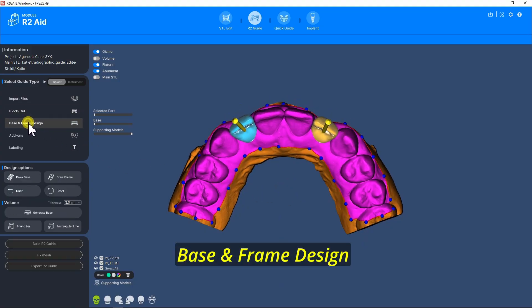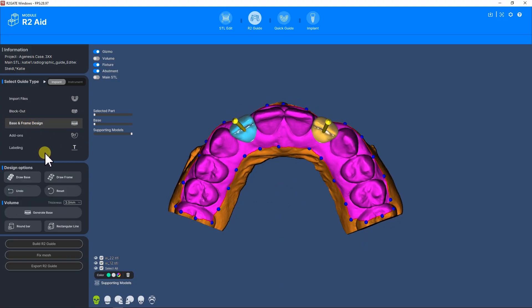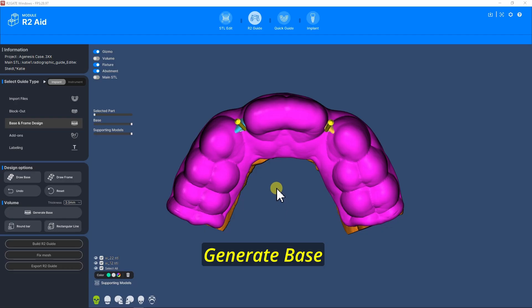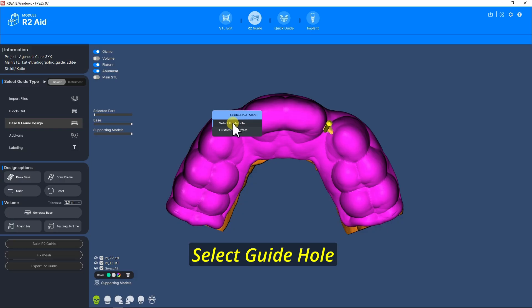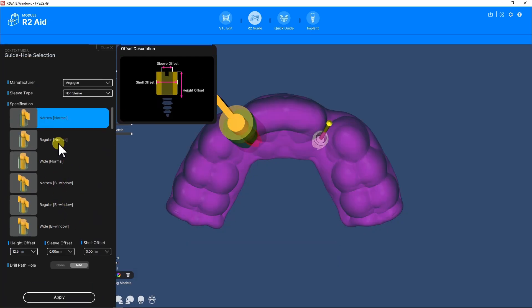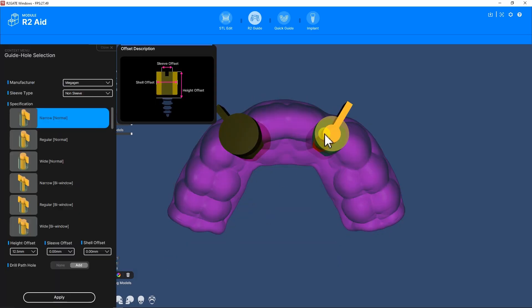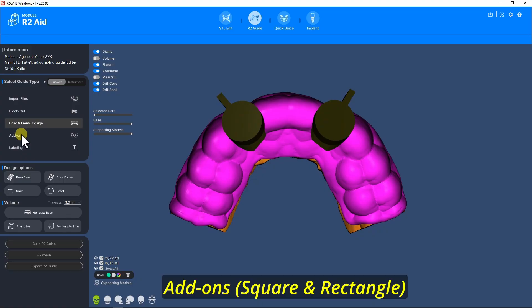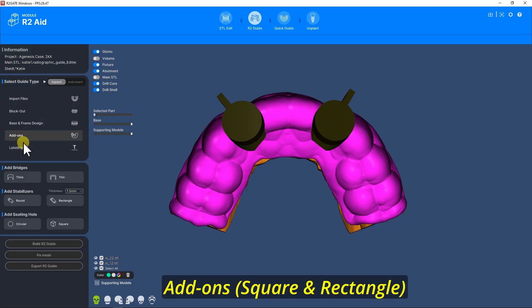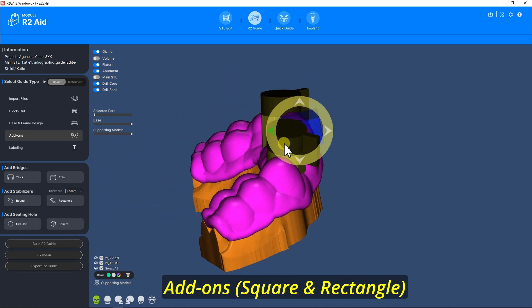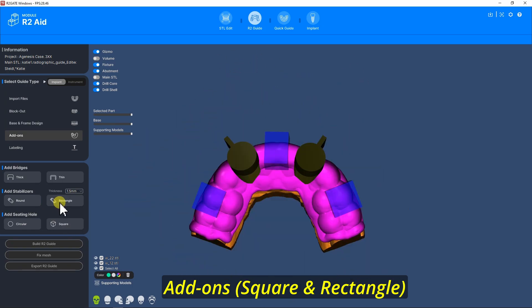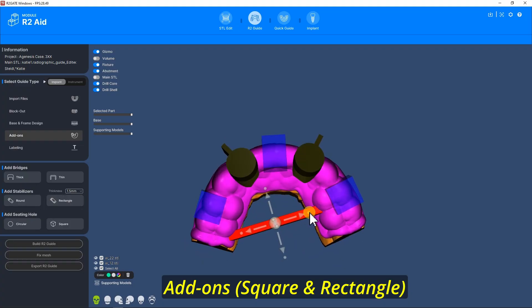Base and Frame Design — Generate Base. Select Guide Hole. Add-ons like Square and Rectangle.